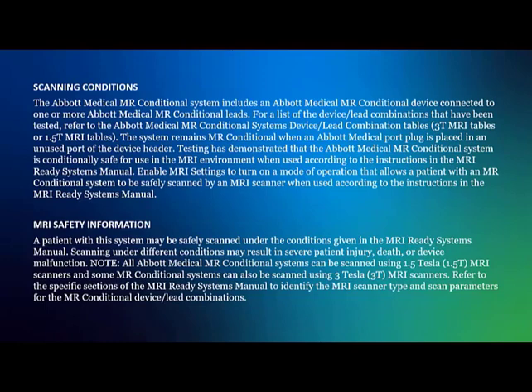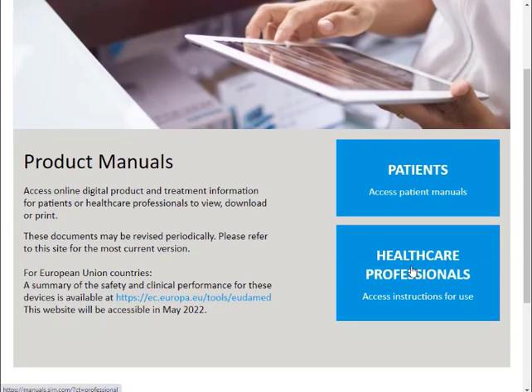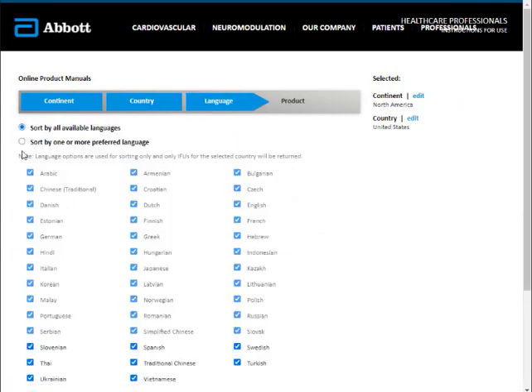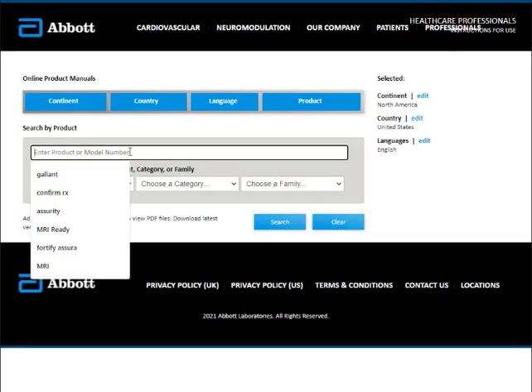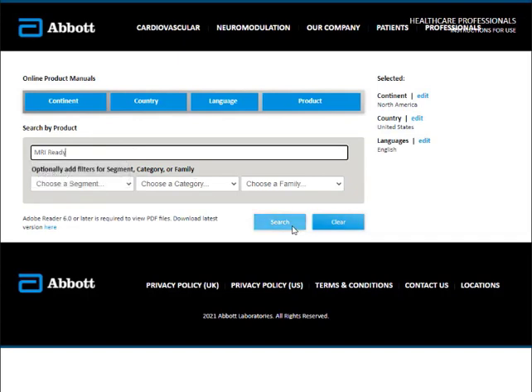For more information about Abbott MR conditional systems, navigate to medical.abbott.com/manuals and select Healthcare Professionals from the homepage. Select the continent and then the country where the product was sold. Optionally, select Sort by one or more preferred language and then select the checkbox next to your desired language. Select Continue.